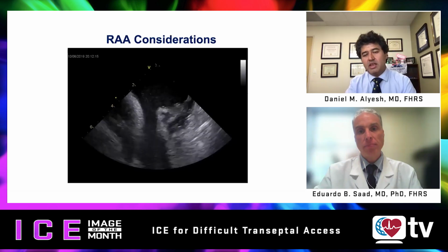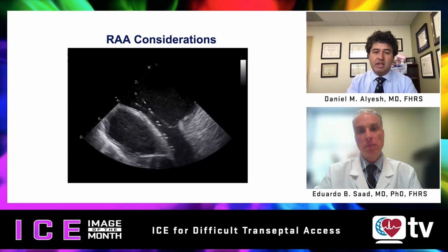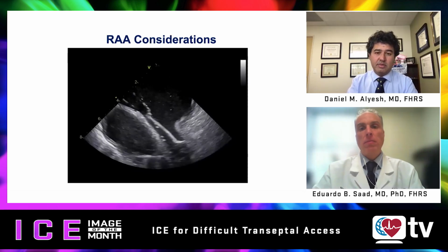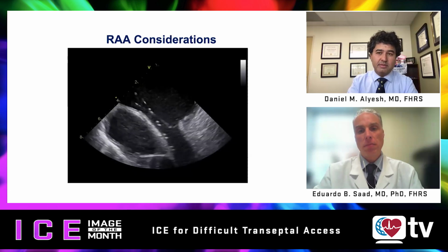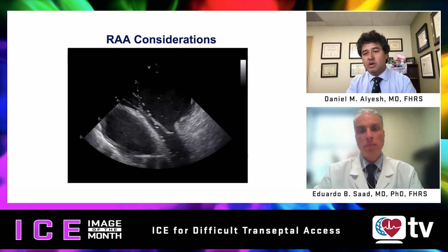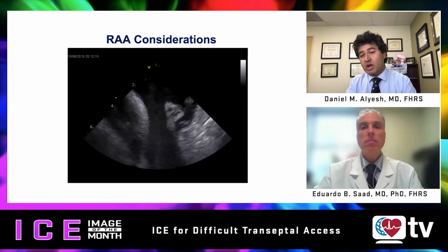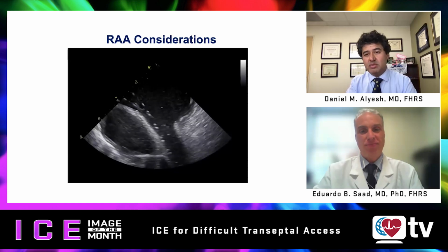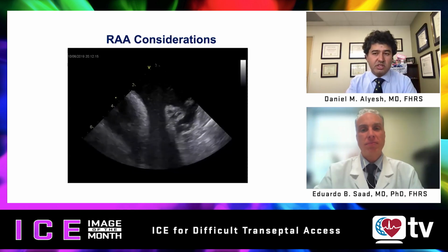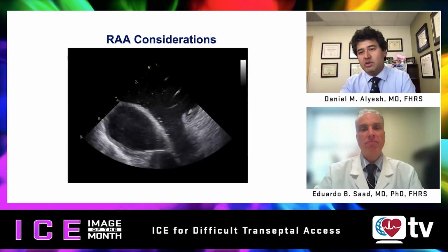I completely agree. From a safety perspective, it's important to understand this close relationship and to see both structures with really good definition. I actually apply variations of this view to leadless pacemaker implants with the Aveir, to visualize where you'd like to be at the base of the appendage. You like to have good tissue contact. So this view has a ton of uses, and it's a great example of improving safety with your eyes.